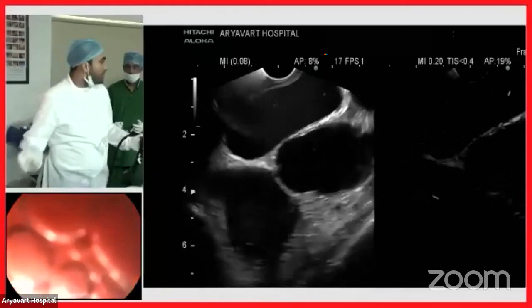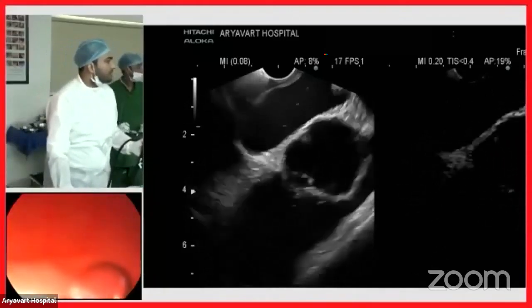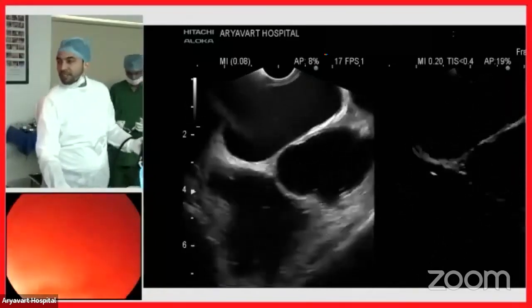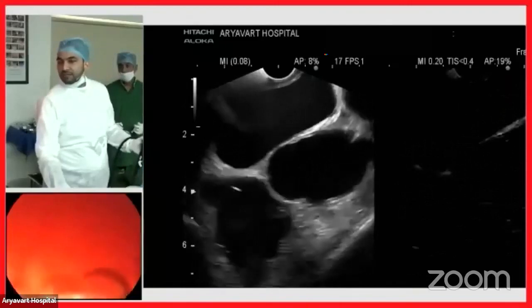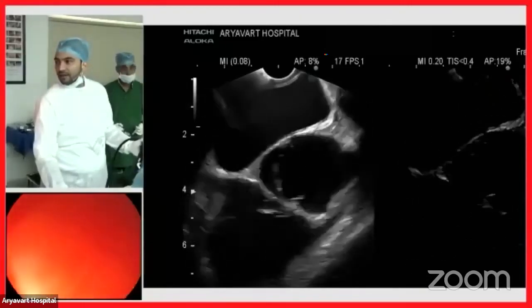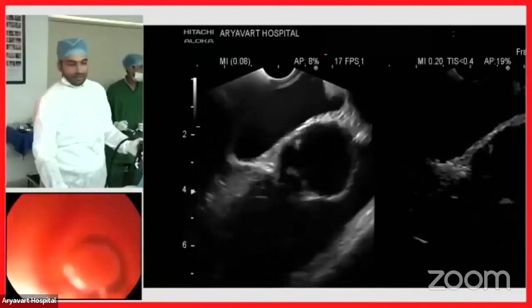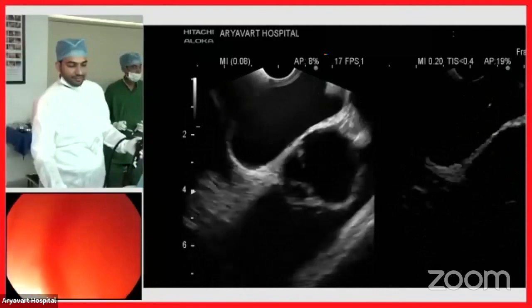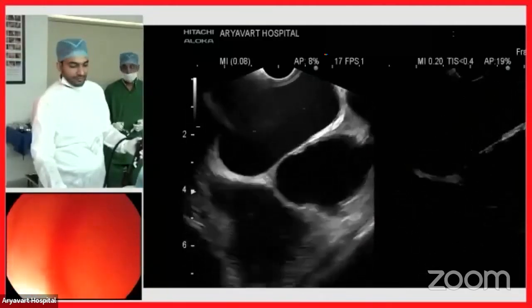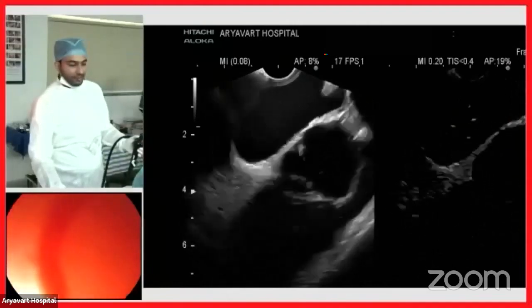Is the contrast okay? Were the bubbles visible, sir? Dr. Malay? Sorry, what are you saying? So were the bubbles visible in the left atrium? The bubbles were visible. The only thing is you waited too long. Once you make the bubbles, they will disappear. So as soon as you make the bubbles, the time delay in injection should not be long. Yes. So you do it again, and this time don't explain, just inject once more. Right. So we'll do that.